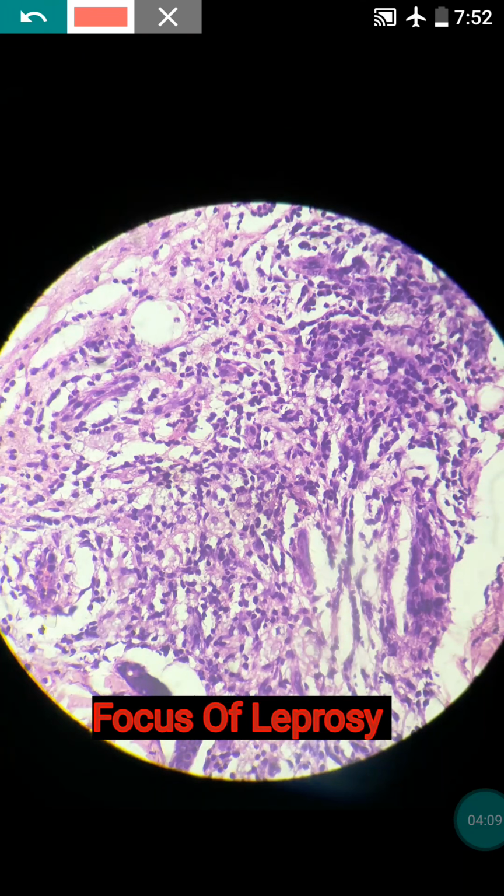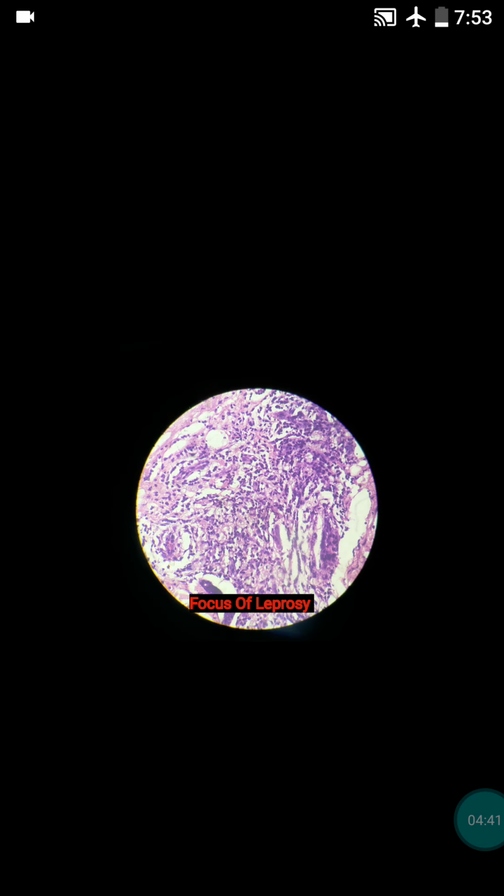These cells have clear cytoplasm, and all these are macrophages. So there is a presence of macrophages, first thing. Another is the presence of many lymphocytes. Can you appreciate these lymphocytes? Whenever macrophages and lymphocytes are seen, your diagnosis will be borderline lepromatous leprosy.